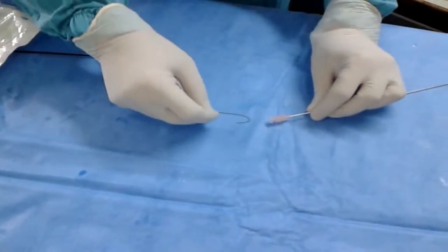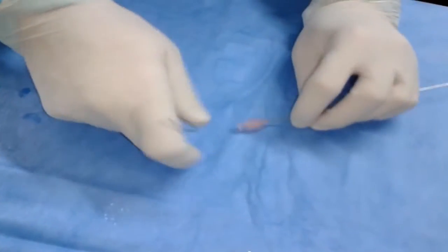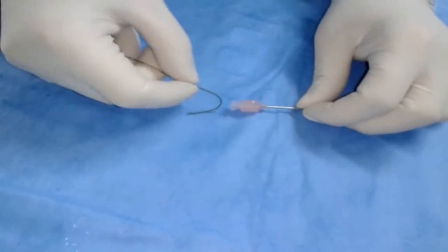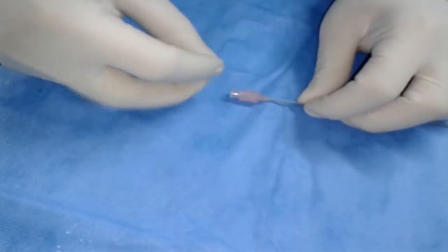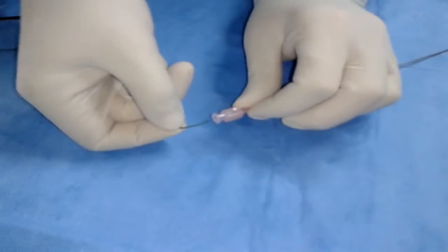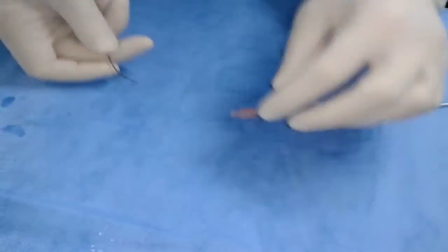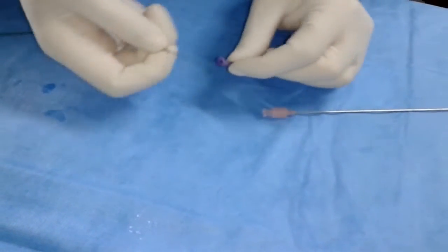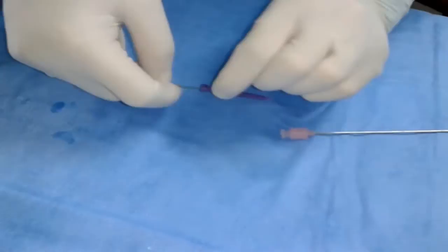In order to introduce a J-tip guide wire in the puncture needle or catheter, the J-tip should be straightened. This insertion can be sometimes tricky and both hands have to be used. A J-tip straightener or introducer can be used, but it's not so simple and also both hands are needed.